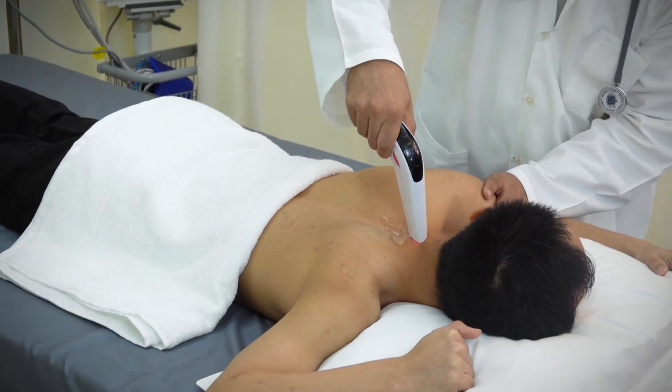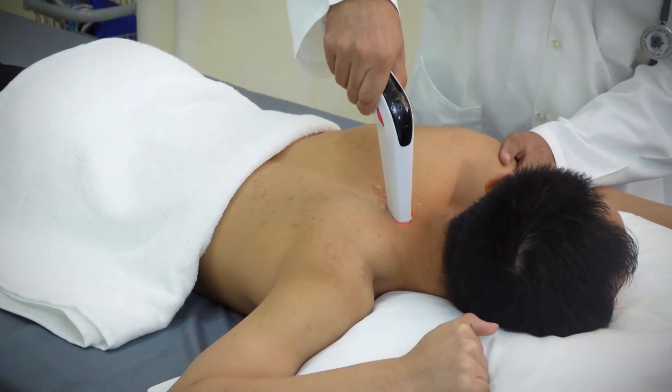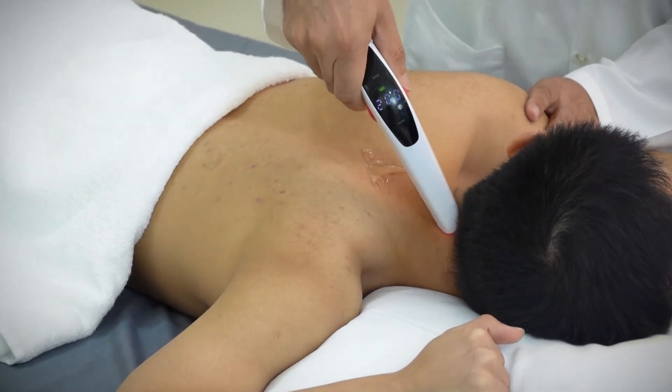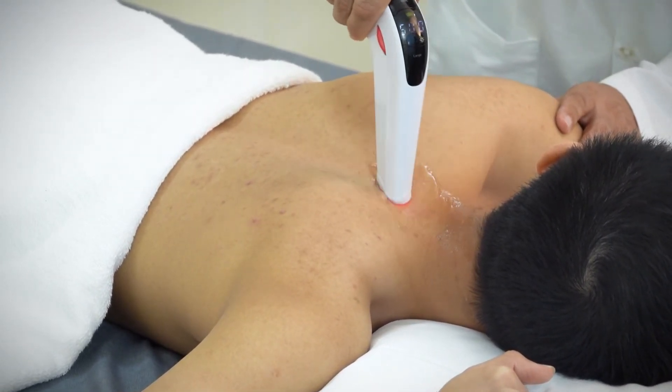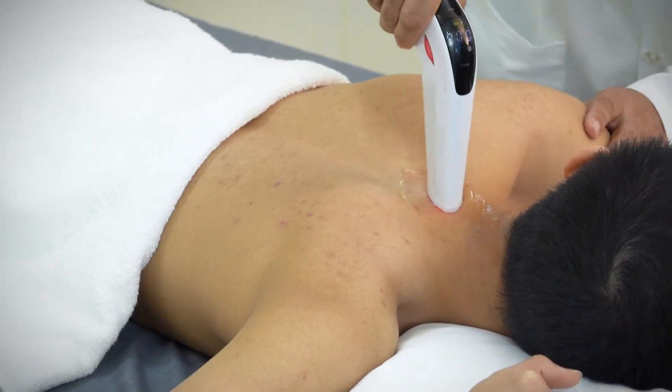Start moving Cura Laser back and forth or in a circular motion over the affected area of the neck. Keep adjusting the intensity of biostimulation during the entire treatment session to ensure the patient's comfort.